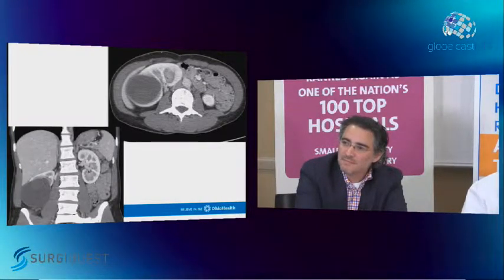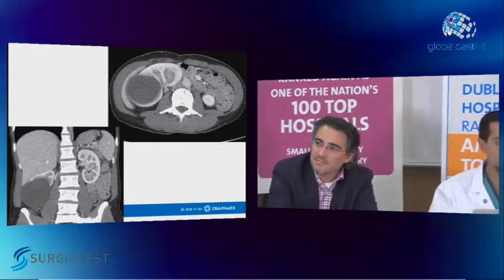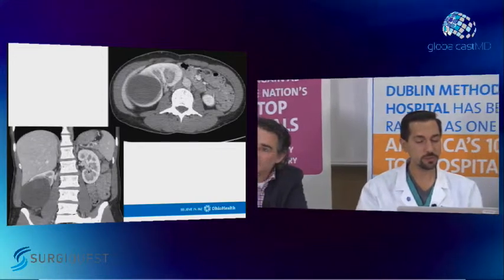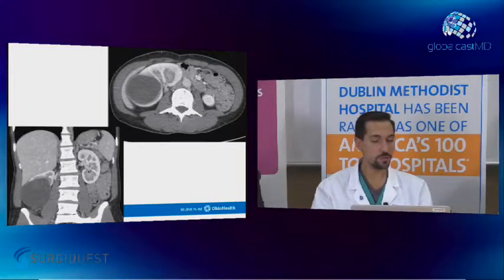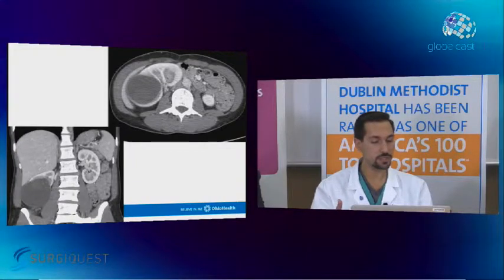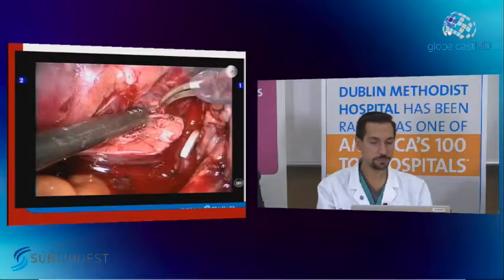It's my biggest concern. So my discussion with her preoperatively was that if we get in there and feel like we can do a partial nephrectomy safely without popping the cyst, we'll do a partial nephrectomy. If we can't, we would progress to a nephrectomy just for the purposes of safety. Again, it's elective. She's got normal renal function, normal kidney on the other side.